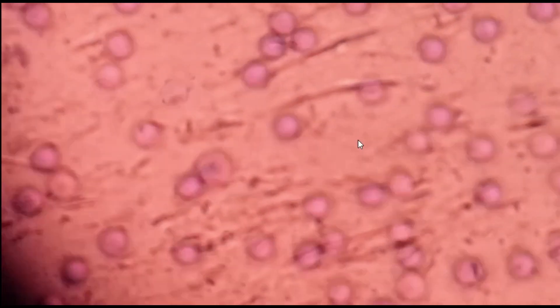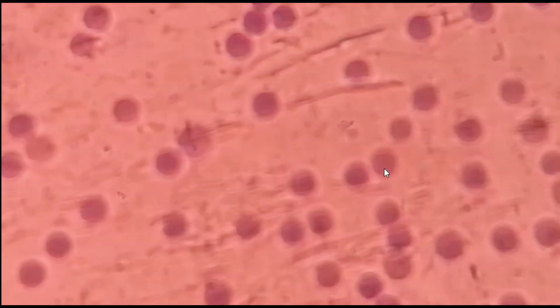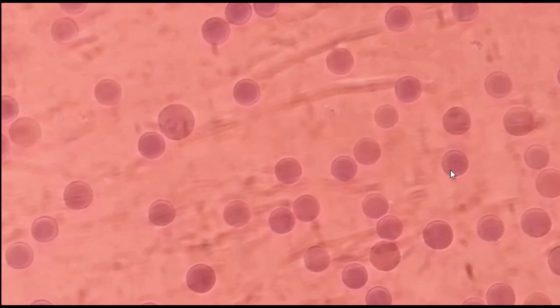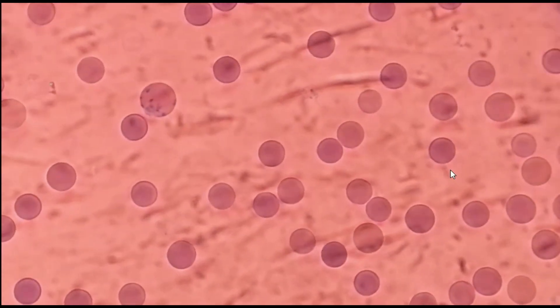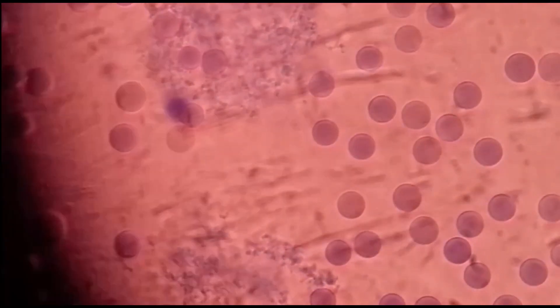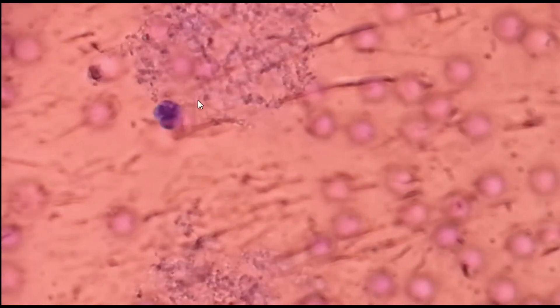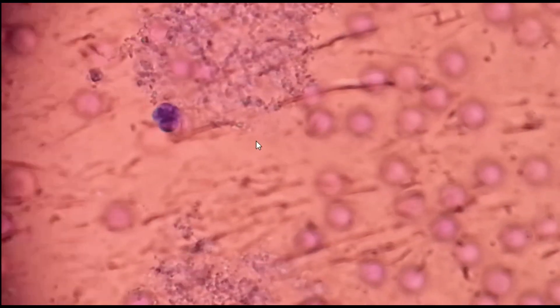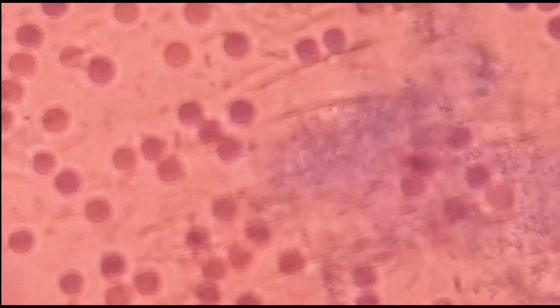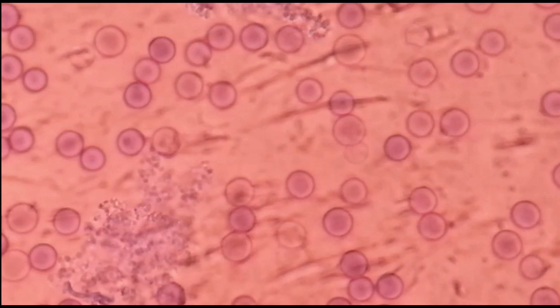Things we should know: the red blood cell population is measured in millions per microliter, whereas white blood cells are measured in thousands per microliter.